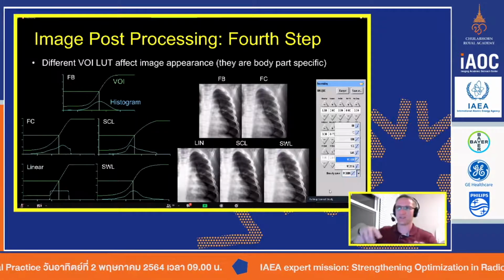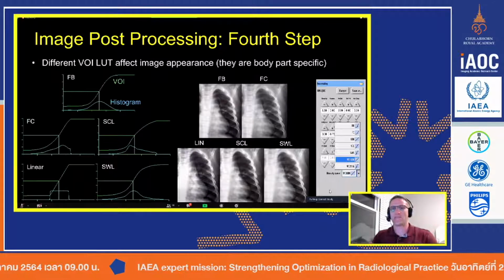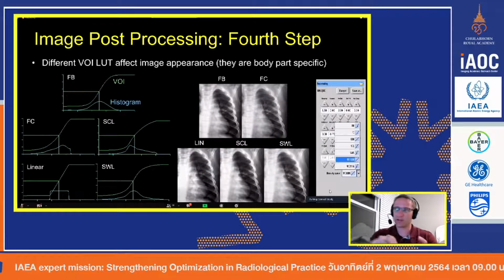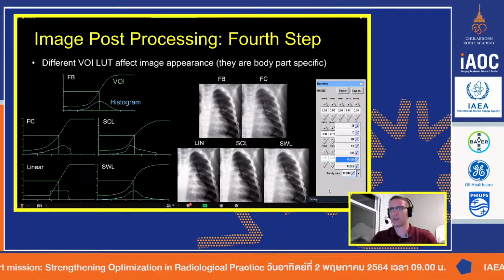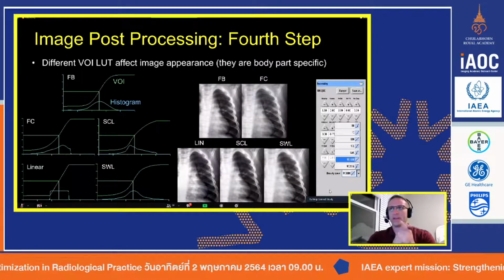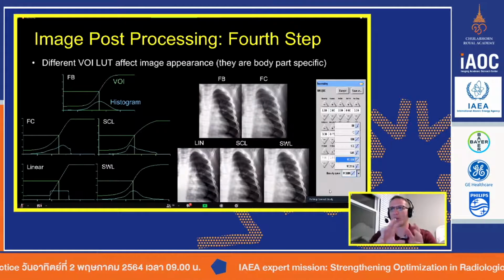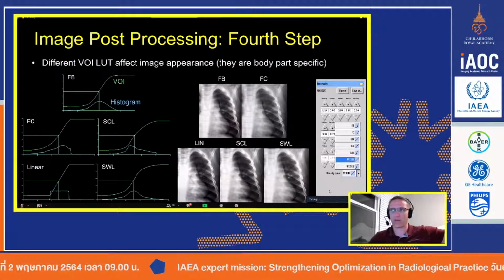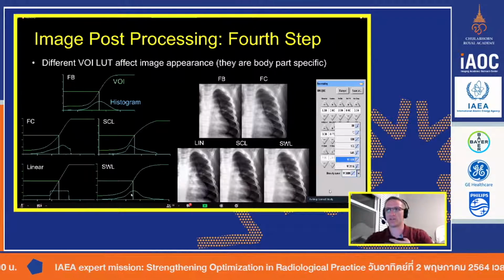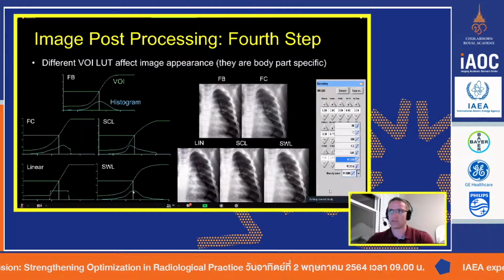If the patient just wasn't centered right, or the patient moved, okay, reshoot it. You just have to acquire a new image. If everything was acquired right and everything should be right, but it still doesn't look right, reprocess it and send both images. Then we're not interrupting the radiologist, who can look at it. And if the radiologist says, I still don't like it, the technologist can always go back and reprocess it. The patient's gone, you can't reshoot them, but you can at least reprocess it. So that's what we do at our institution. We've given a lot of authority and control to the technologists, who are smart people.